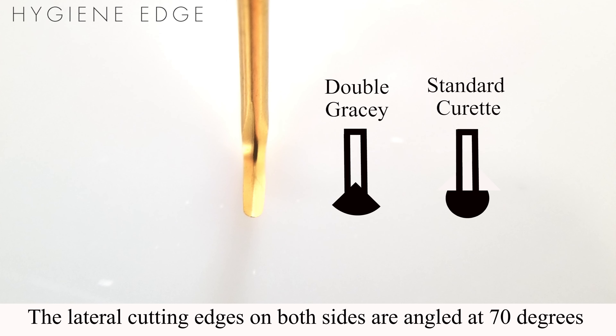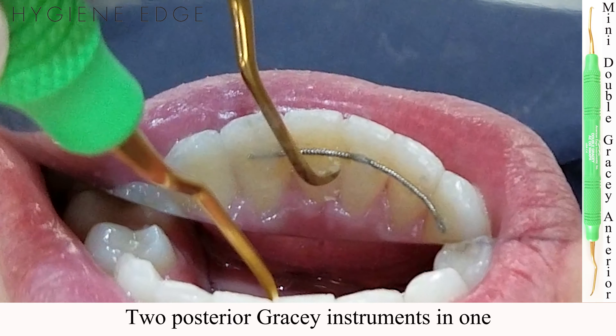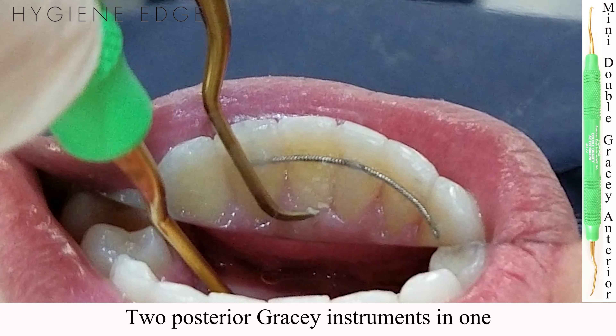The face of the Double Gracie Minis are engineered such that the lateral cutting edges on both sides are angled at 70 degrees. This allows for scaling the entire tooth without needing two separate Gracie instruments, similar to a universal curette.